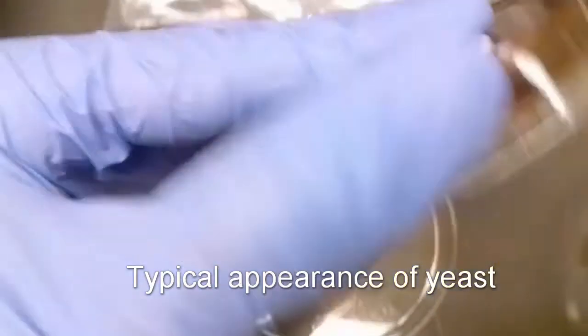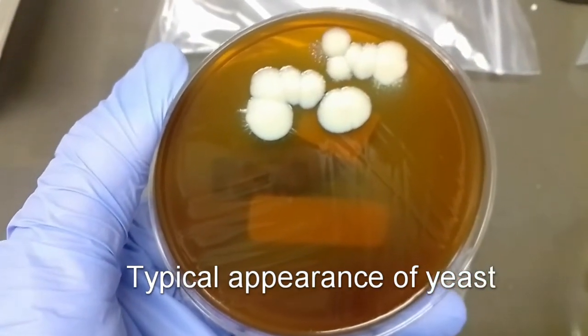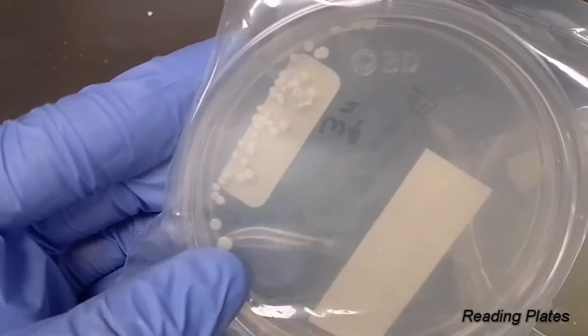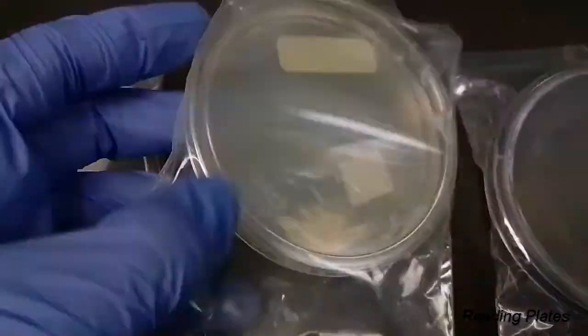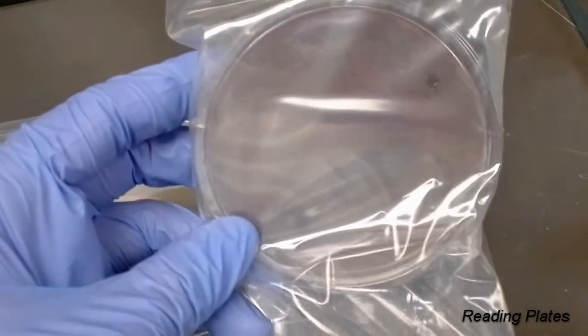If you have growth only on your potato dextrose plate and no growth on your BHI plates with antimicrobials, you can presume that it's just bacteria growing, because yeast will grow on that BHI plate with antimicrobials as well. So if you see growth on both plates, it is indicative of yeast and it's going to have that typical appearance. In this example, you can see four plates with growth only in the first two — SAB and potato dextrose — and no growth on the last two plates, IMA and BHI with gentamicin and chloramphenicol. That clues you in that this is bacteria and you don't need to worry about it.